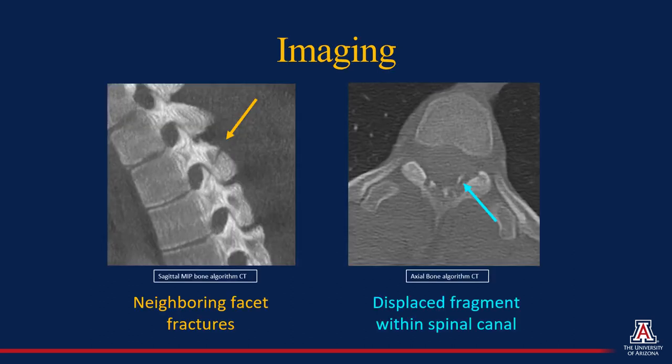The trauma team elected to obtain CT, shown here with CT of the thoracic spine. This demonstrated a fracture through the facet of the upper thoracic spine, including a displaced fragment which was visualized within the spinal canal on axial images.